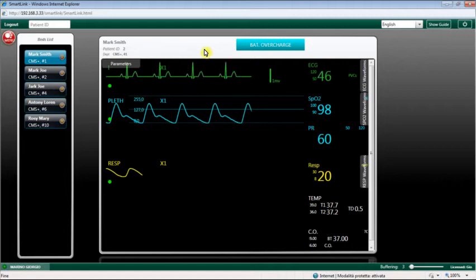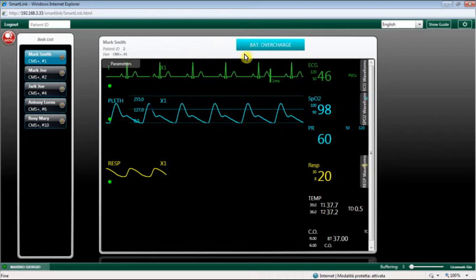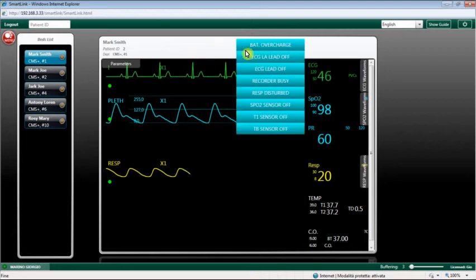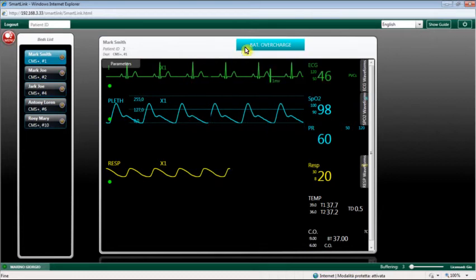On top of the waveforms window, there's the alarm messages bar. The colour of the bar is the same as the highest alarm level received from the patient's monitor.